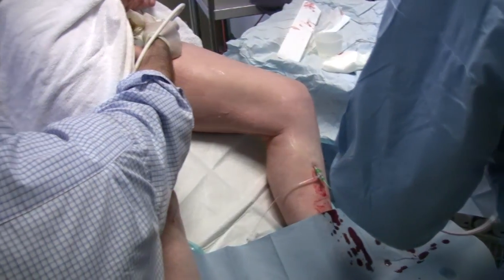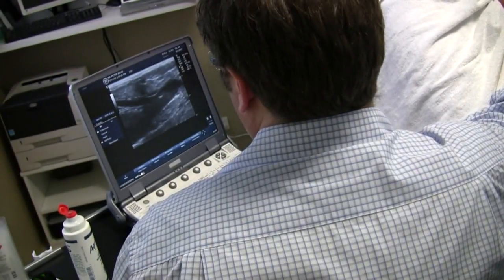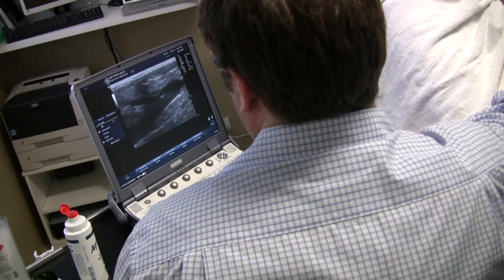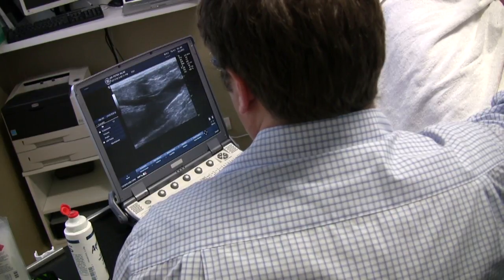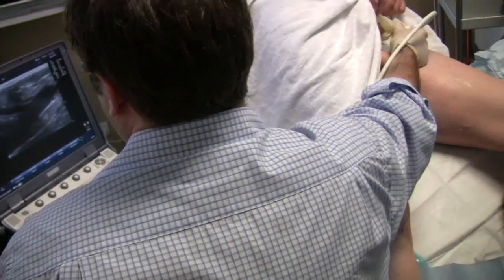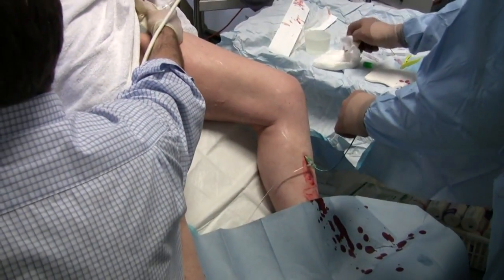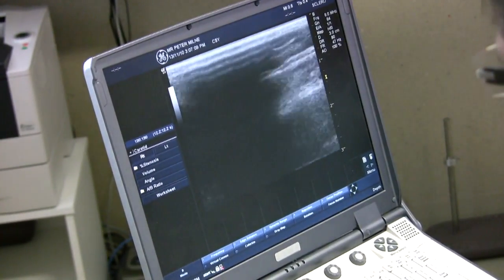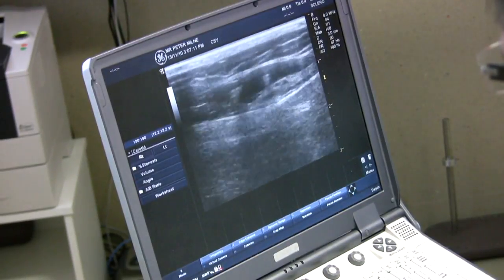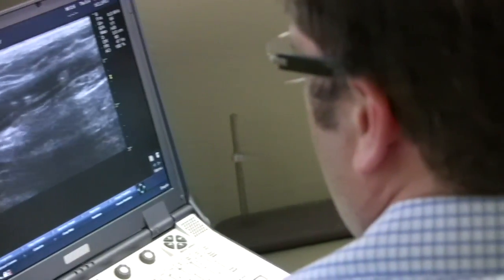In this case, the actual junction is now going to be ligated by the introduction of an occlusion coil at the junction itself. One can see on the screen the wires across the junction of the leaking vein to the main vein at the groin. One can see on the screen the placement of the occluding ligation coil occurring within the vessel lumen, which you can see by the white shadows on the black background, indicating accurate sealing of the junction.